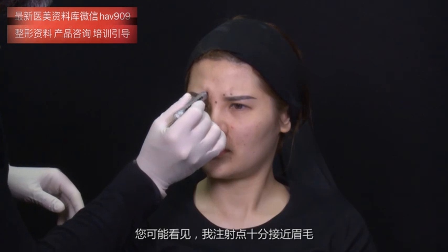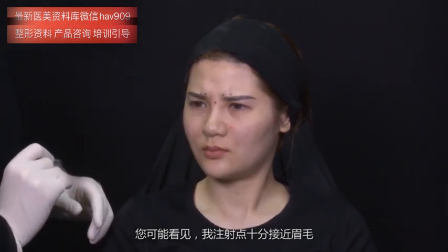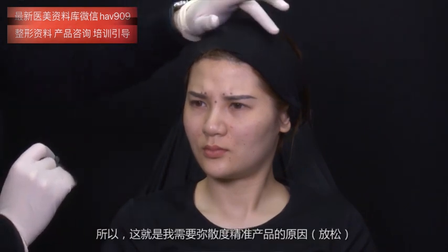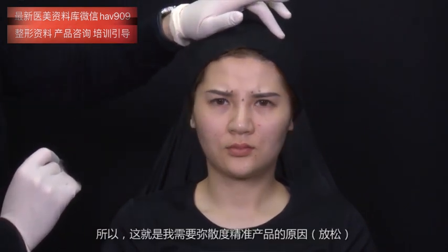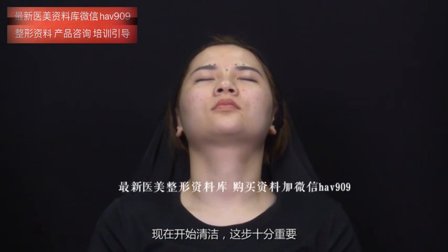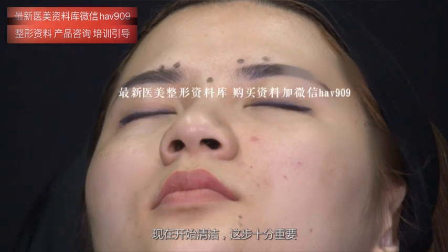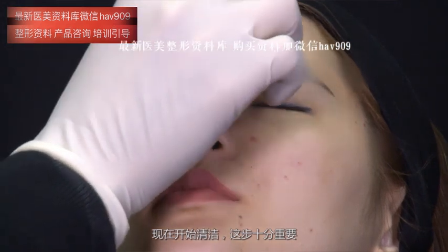And as you may see, I inject very close to the hair. So that's why I need a precise product. Relax. Now, let's go and clean. Cleaning is very important.